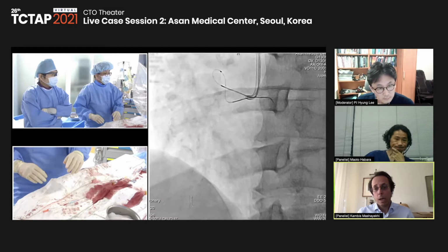The hematoma can be controlled with a mother and child catheter, which has to be advanced into the CTO body. And then we have to be sure that we don't lose the big side branch. So this must be an absolutely controlled reentry at that point, and we have a high chance of reentry there because there is not a lot of calcium. So I think the case is very well chosen for educational purposes. It's a very good case regarding IVUS controlled puncture.